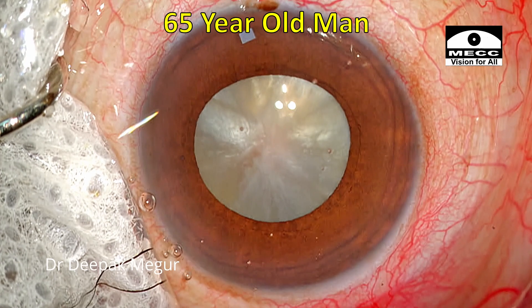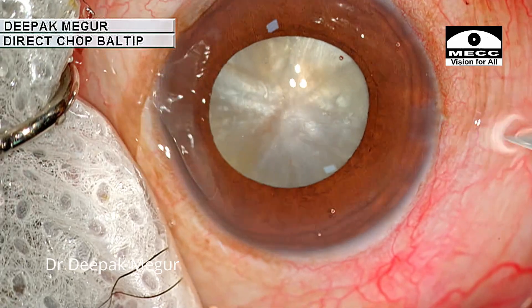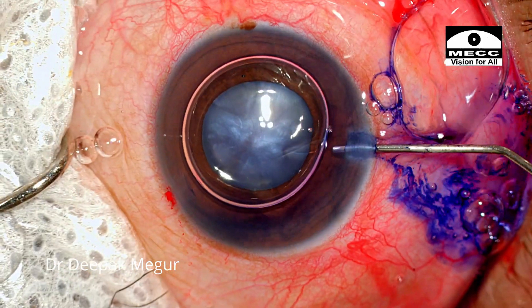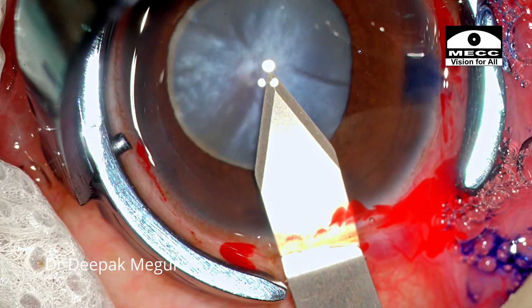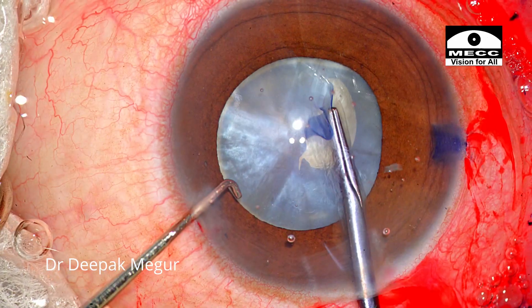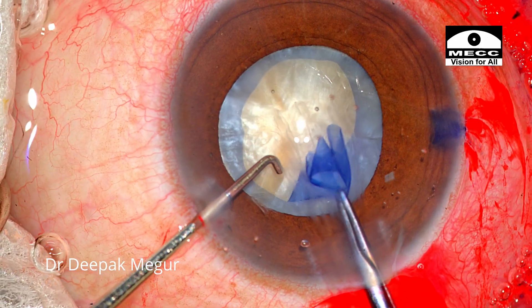Moving on to the next case. This is a 65-year-old gentleman who has had a stroke and is having hemiplegia. The cataract is quite long-standing and delayed. I'm expecting a slightly denser nucleus beneath this swollen cortex. The surgery is being done under posterior sub-Tenon's anesthesia and the patient was slightly uncooperative. After making the side port incisions and staining of the anterior capsule, viscoelastic is injected. I'm using cohesive high-density viscoelastic, sodium hyaluronate 3%. The rhexis is around 4 to 4.5 mm, so dividing a denser nucleus is going to be a challenge with this size of rhexis.